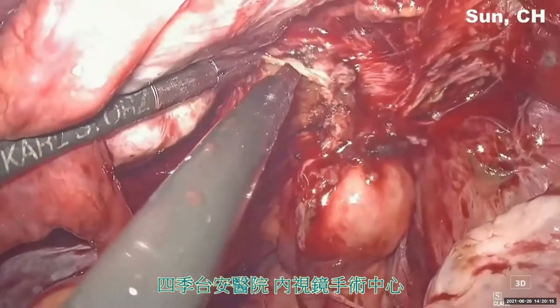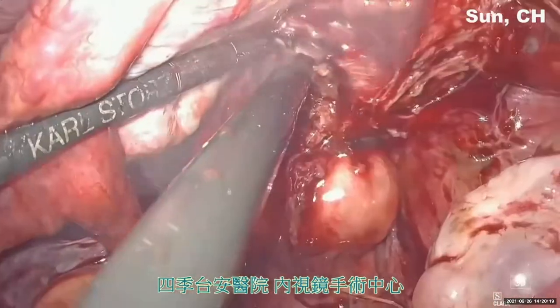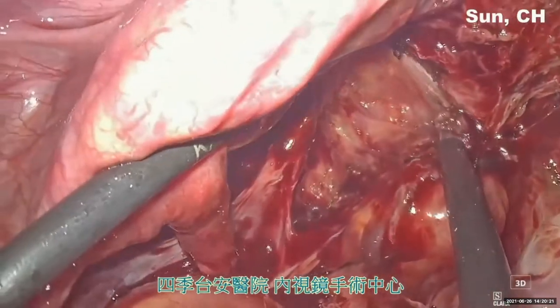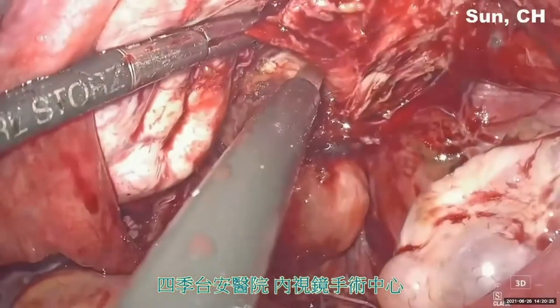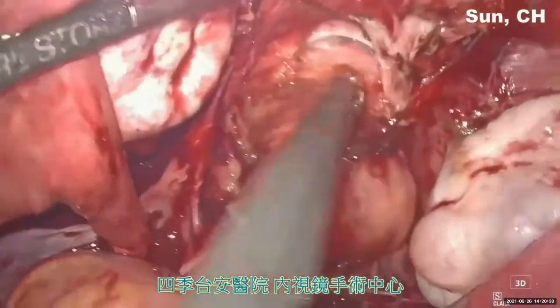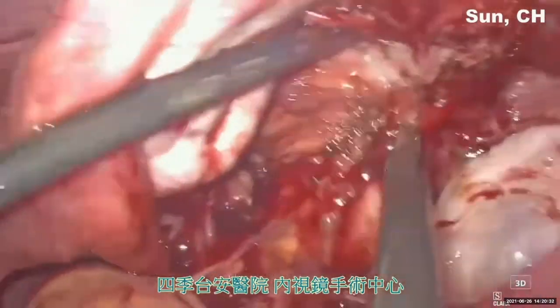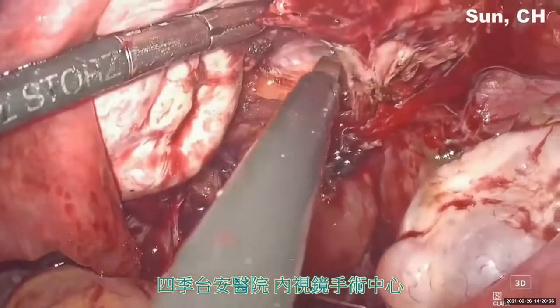space. As you can see here, my left hand is grasping the uterosacral ligament. Remember the principle, fat belongs to the rectum. So we are going along with the fascia and leaving the fat to the rectum. Now we have already entered the rectovaginal space correctly.